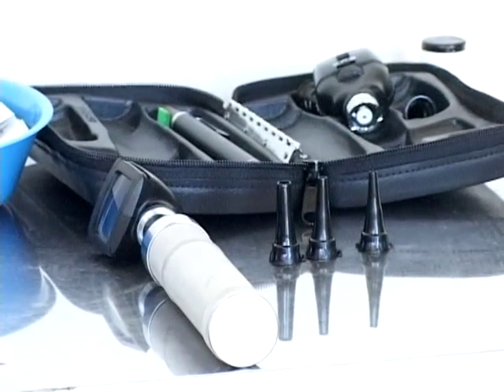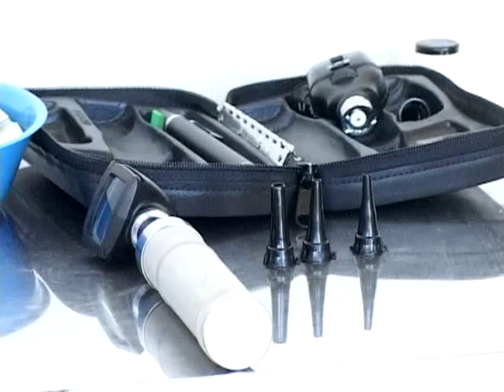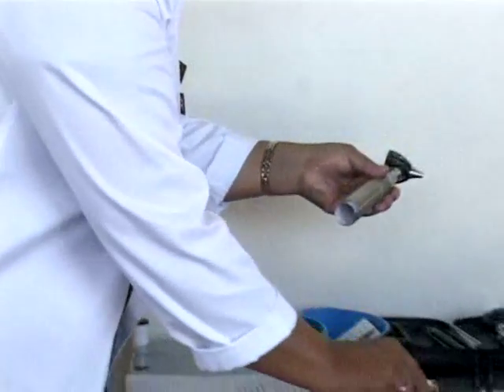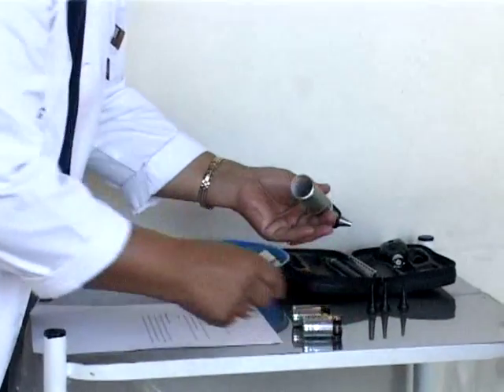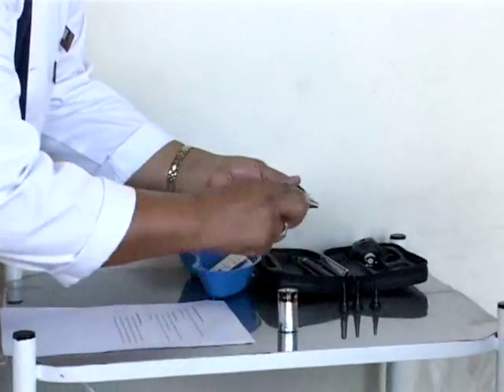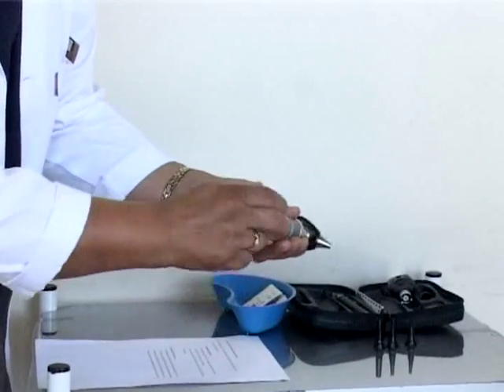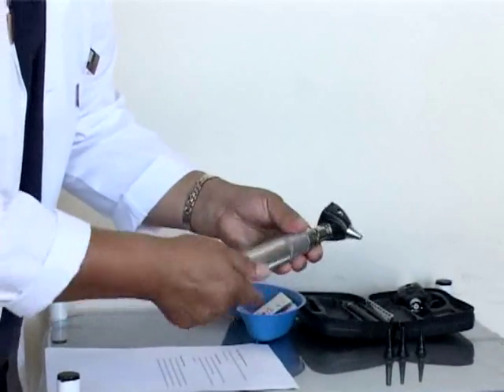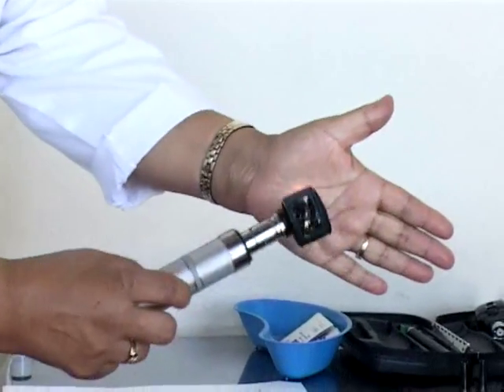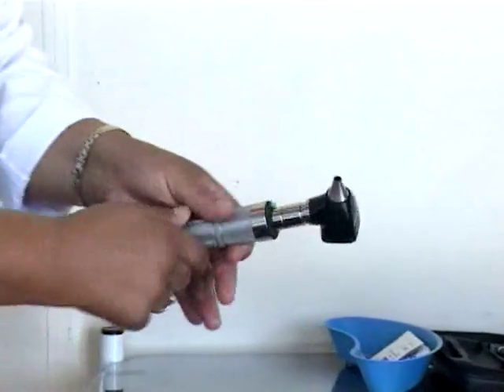The otoscope is the instrument we use to do the examination. When using the otoscope, remember that the batteries must be in very good condition, because if the batteries are not working properly you won't have good lighting. Put the batteries in the otoscope and check the green light button to confirm the light is working.